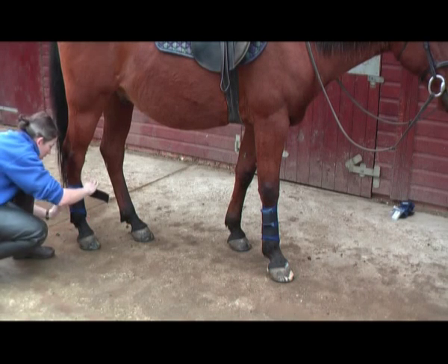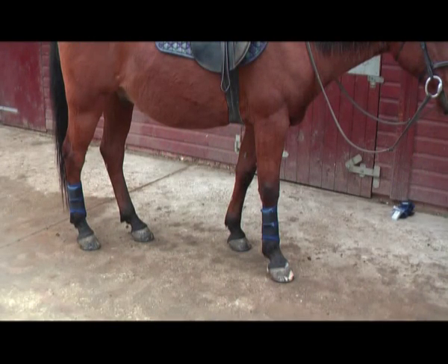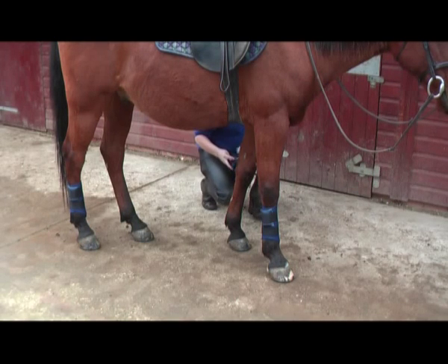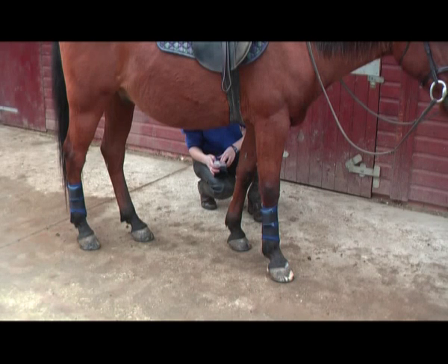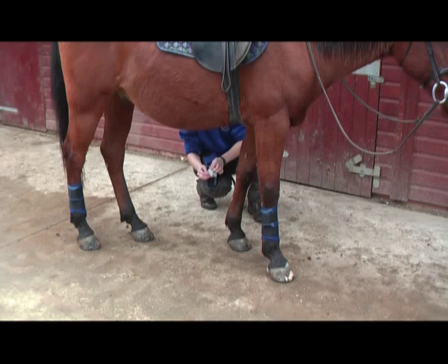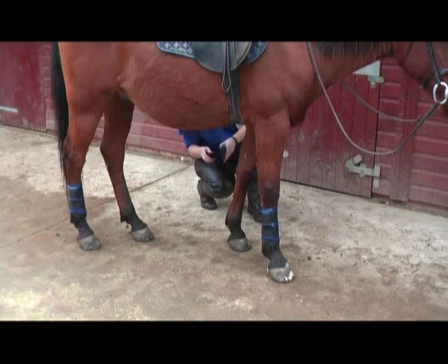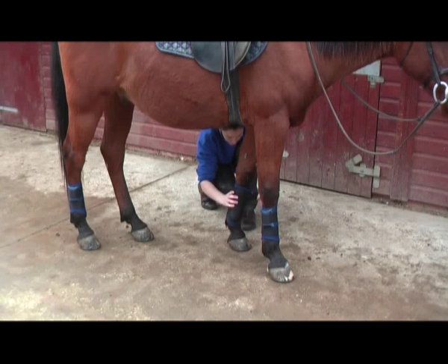Secure the bottom strap and then the top strap over the sensor in the pouch. I'm checking that this is the correct sensor for the correct leg — it is indeed the left leg. There are no lights present on the sensor. I switch my sensor on with the little black button and I now see a green flashing light, which means we're collecting data. I put my sensor into its pouch and secure the brushing boot with the bottom strap first and then the top strap over the sensor.